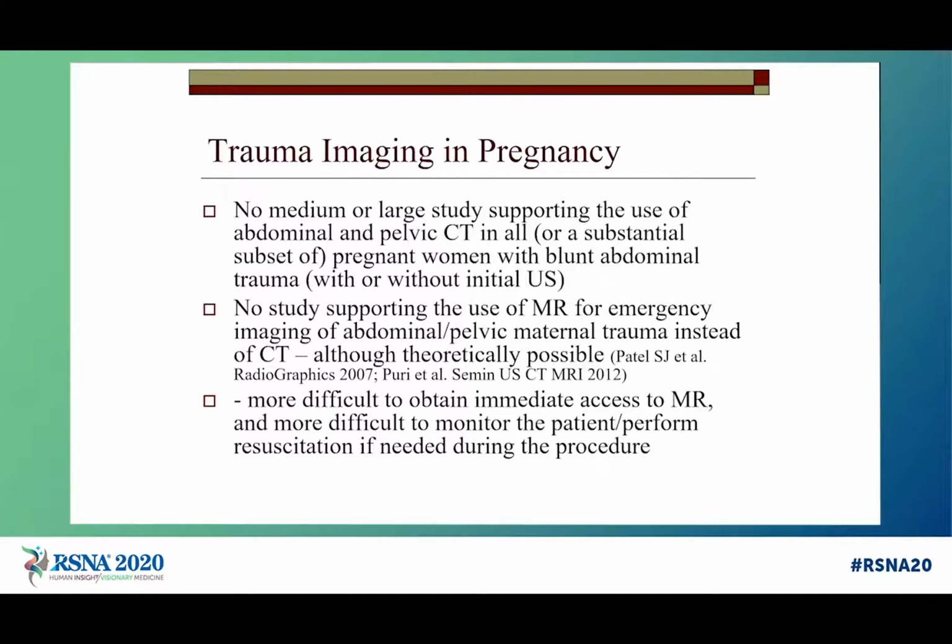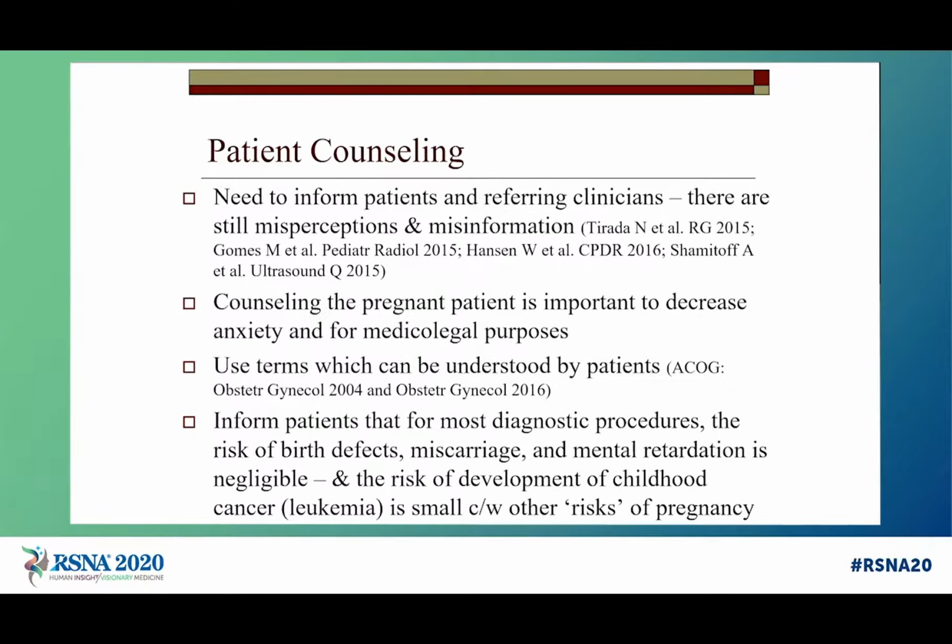MRI, very little published on this. Every time I look at the literature, there's very little that's actually been published. We've done just a few number of patients in the more stable scenario. Of course, there are challenges in terms of bringing a trauma patient who's pregnant to the MR suite, even if you have one that's close to the ED.